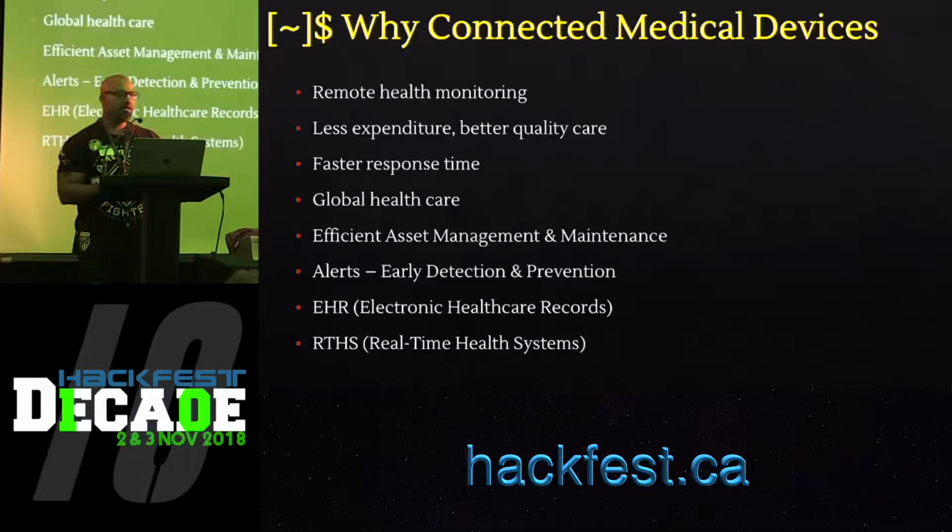So we took the very obvious logical step, because we noticed that there was an IRDA port exposed. From a pen tester's perspective, our next goal was to connect this infusion pump to our wireless network. So we brought up our own access point, configured it with the same settings as on the infusion pump, but it didn't connect. The reason was that it came pre-configured with a username and password, and we didn't know that username and password, and we couldn't change it on the infusion pump. So we were kind of stuck.